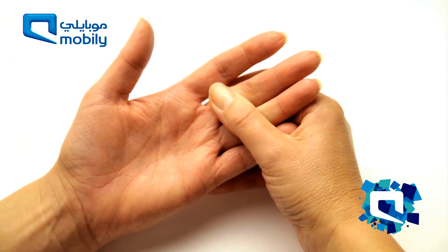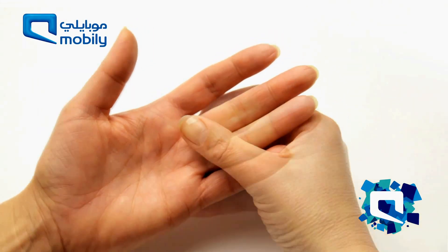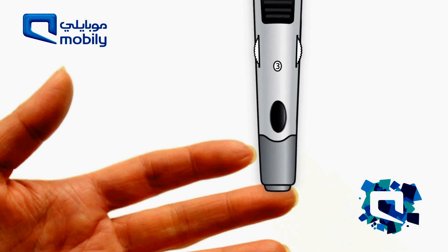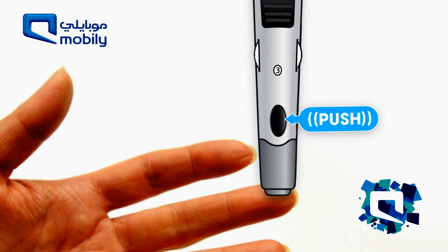Massage the finger to improve blood circulation, and press the lancing device against the ring or middle finger. Press the button to obtain a blood sample.